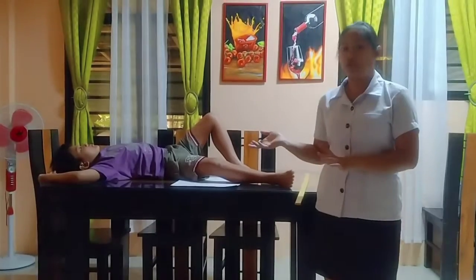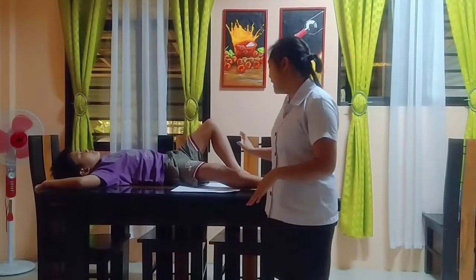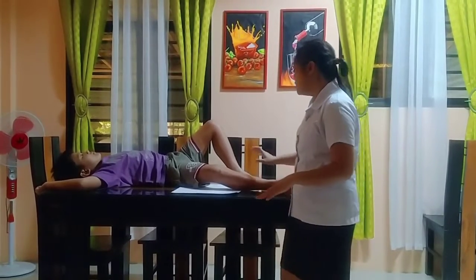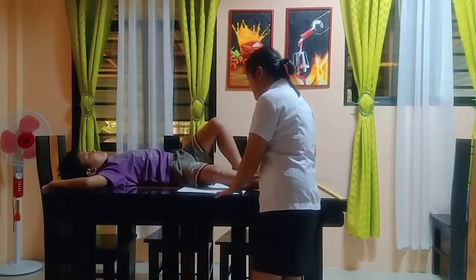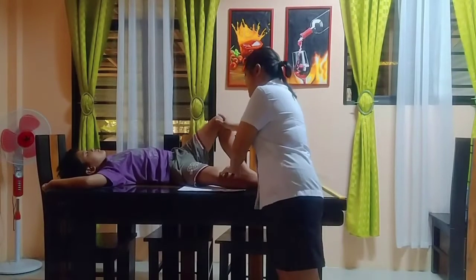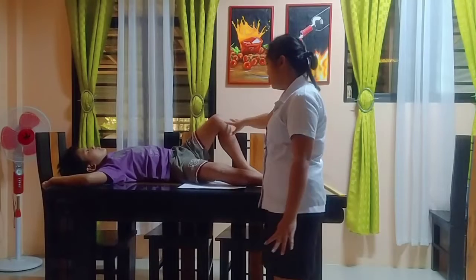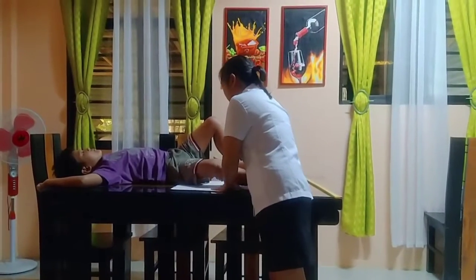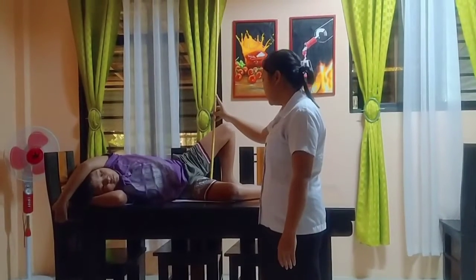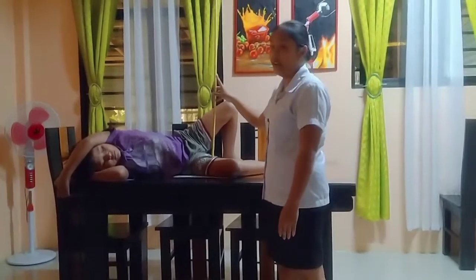Next projection will be the lateral projection of the femur, placing the patient in the lateral recumbent position. So, itong knee po ng patient is slightly flexed. Ensure po na abducted ang dalawang limb para po hindi magkaroon ng shadowing. The central ray will be perpendicular at the midpoint of the IR.